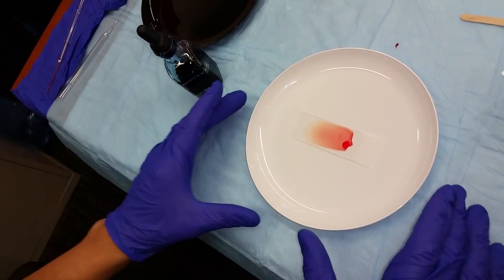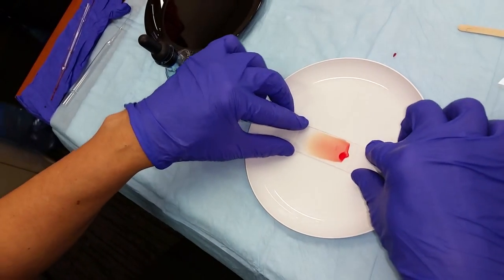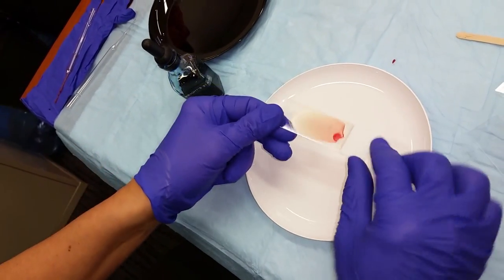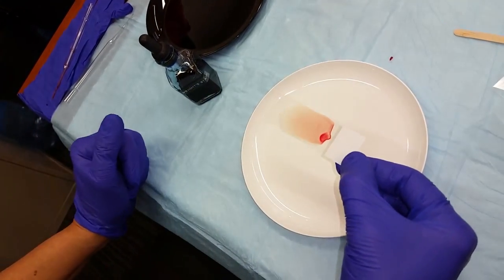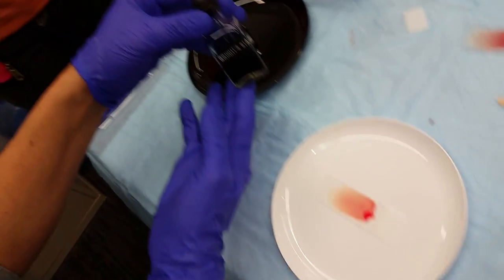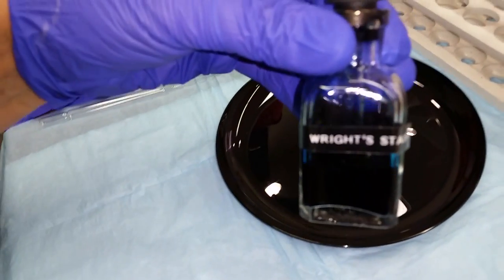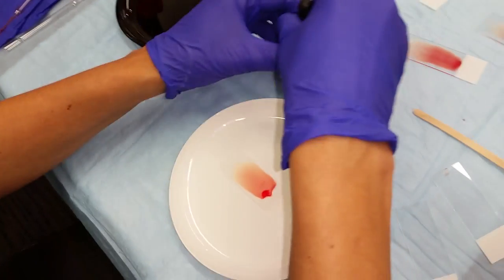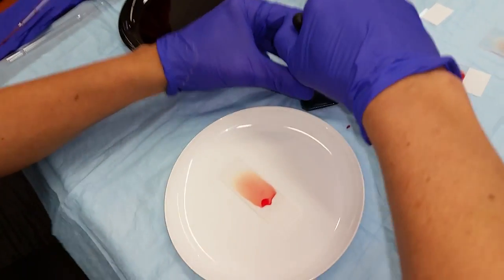To stain the peripheral blood smear, you are going to place the slides along a rack over the sinks in the lab room. You are then going to take Wright stain and completely flood the slide with the Wright stain.